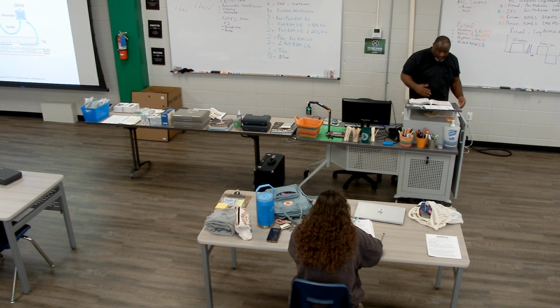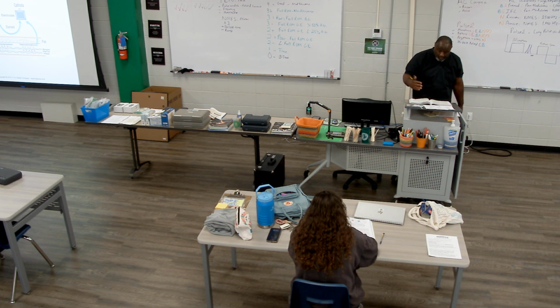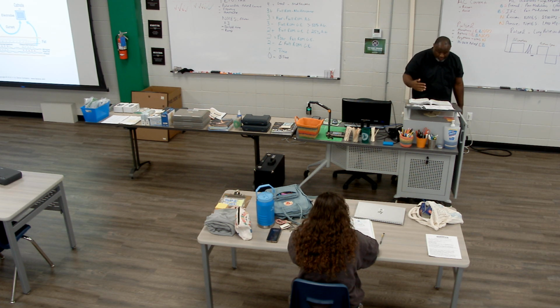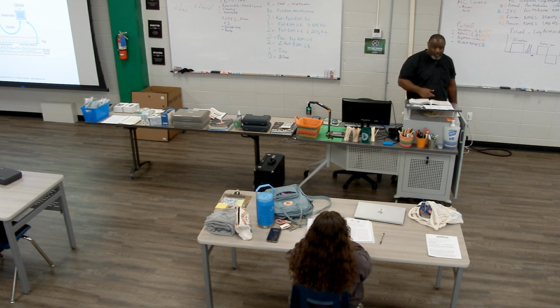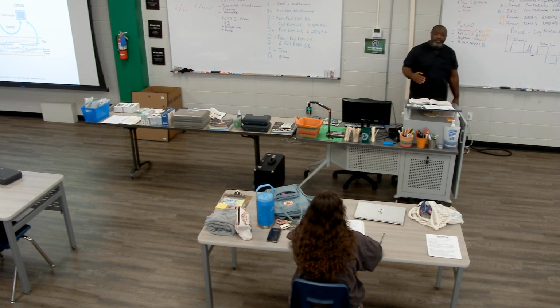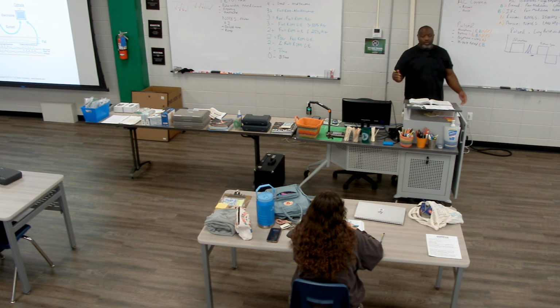Although both anode and cathode are going to be required to have a complete circuit, the cathode, or the negative electrode, is usually referred to as the active electrode, because nerve activation takes place more easily under this electrode. So when we're doing things that have charge to them, we hadn't had to deal with this in anything else because nothing else really had a charge.